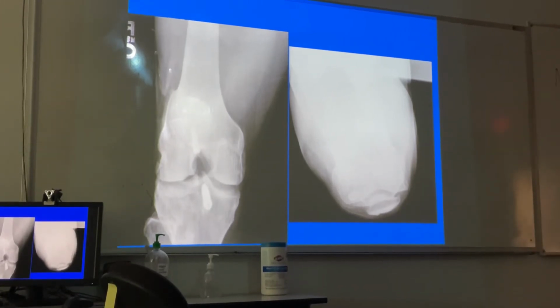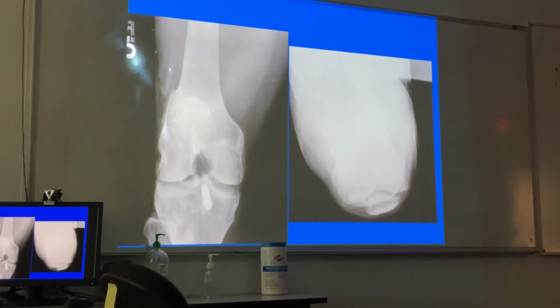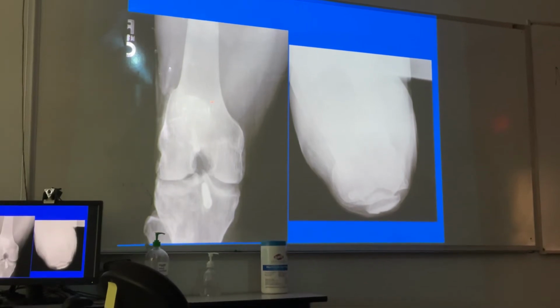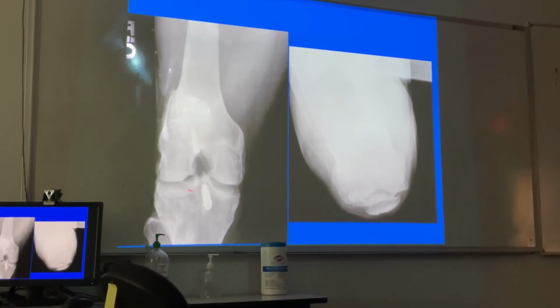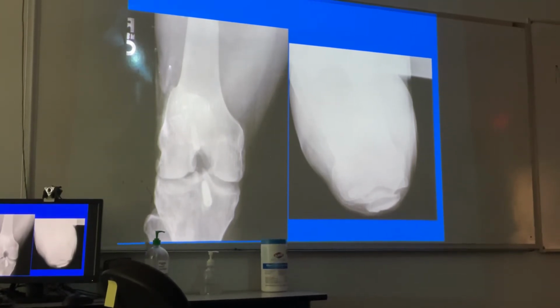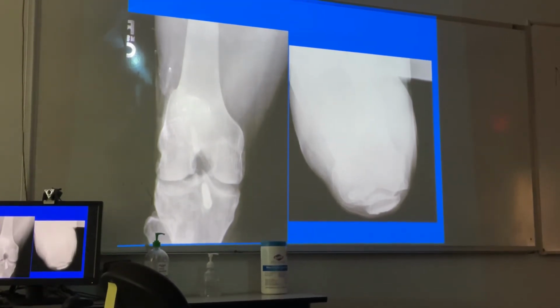If I was in your shoes, I'd get the post-surgical report, what was done, so that I can say this is 2022, 2 years ago, they had a reconstruction, but the patient now has pain. What did they do previously, and what do I have to be aware of? If there's going to be a mess, it's going to be within the first 4 to 6 weeks, my suspicion, okay? I'm just showing you what it looks like on an AP. We're going to talk about knee positioning. This is just what it looks like on the x-ray.